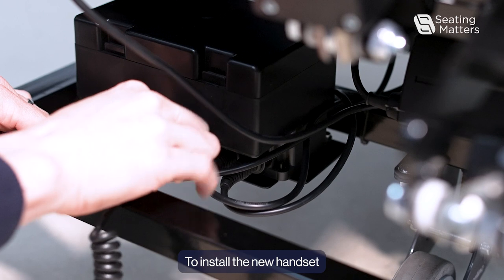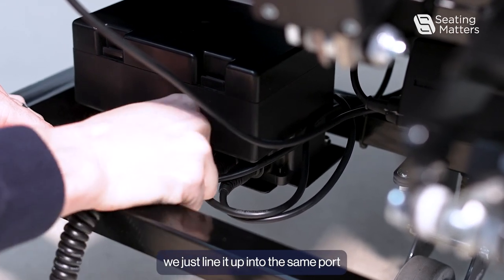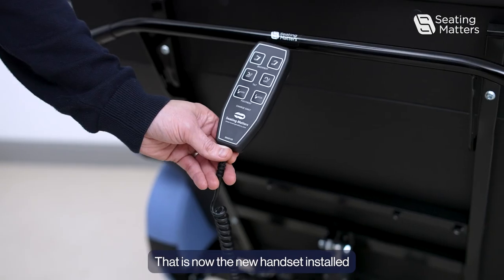To install the new handset, we just line it up into the same port and push it fully in. That is now the new handset installed.